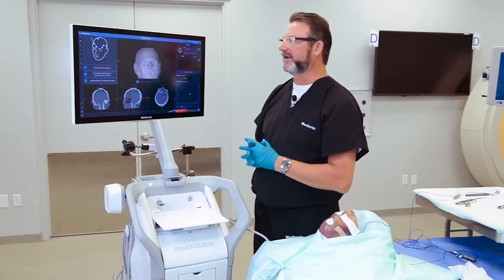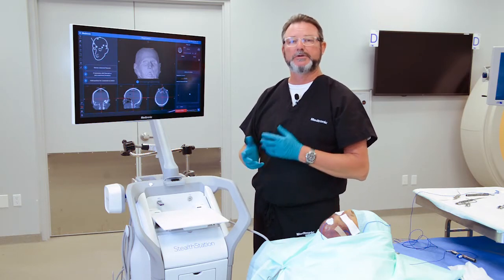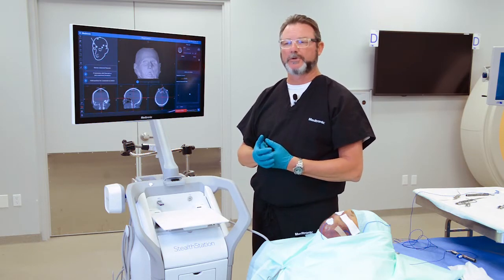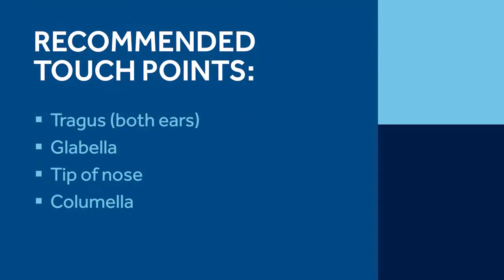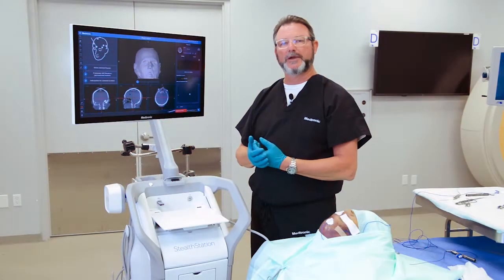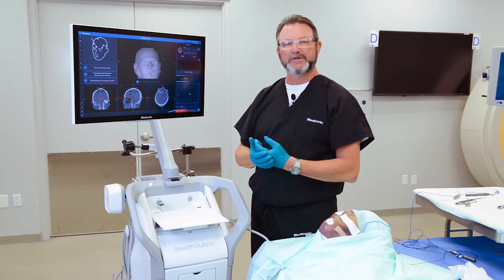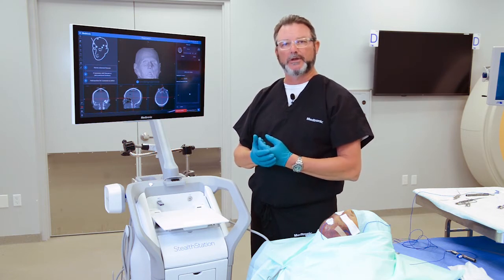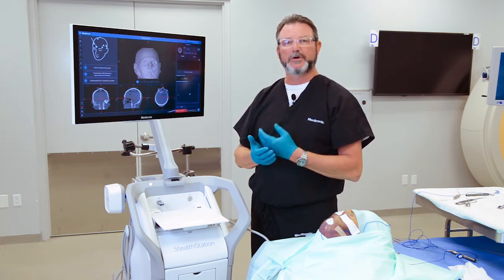The next thing we're going to do is select five landmarks that we're going to use for registration. The ones I recommend using are the tragus of both ears, the glabella of the nose, the tip of the nose, and the columella.